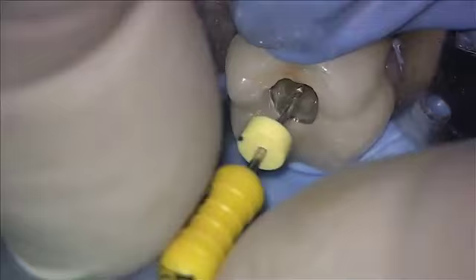Here's a 15K file slipping through the end of the root canal. Here's a 20 — it slips past the mesial buccal cusp tip. Here's a 30 — it's binding about a millimeter short. So I'm going to balance force this little guy to length. I just need to cut a millimeter and a half or so.